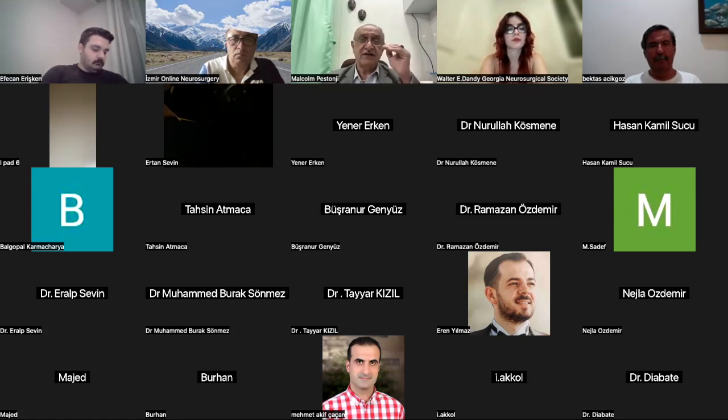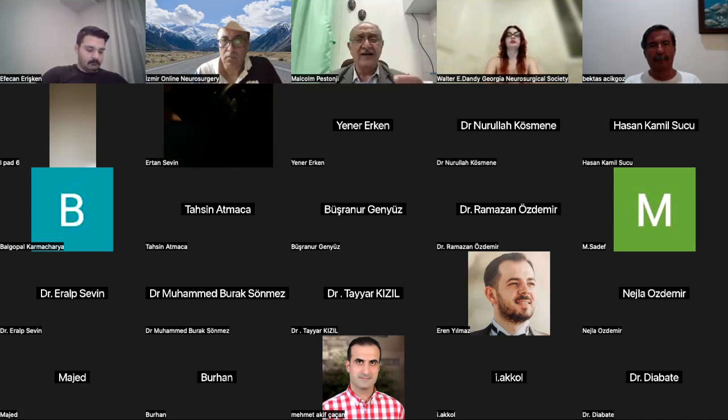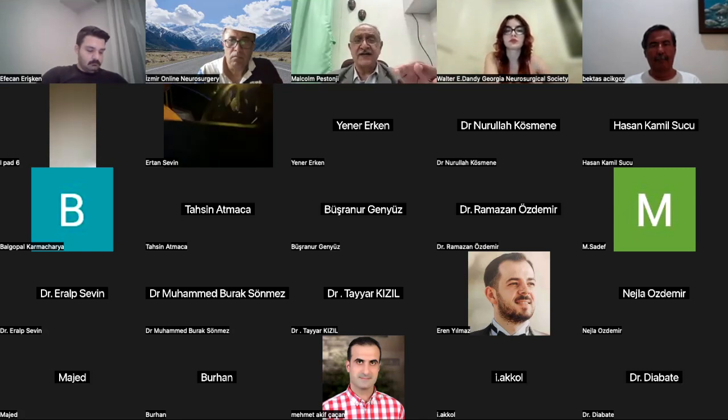So yes, a certain level of technical finesse and calculation, or certain instruments that tell you the size. Now I have a 90-degree ball tip hook which starts from 2mm, 2.5mm, 3mm, 3.5mm, up to 6mm. I have all of them in my set. I just need to put in a right angle hook inside and it tells me the size. Yes, Malcolm, the size is 5mm. So I know, okay, now I've created a 5mm trough.